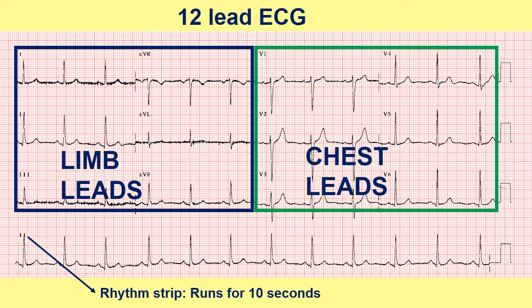And just to state, lead is different from electrode. You actually connect 10 electrodes when you are putting the stickers, but you end up getting 12 leads. So how is this possible? We'll go over that now.